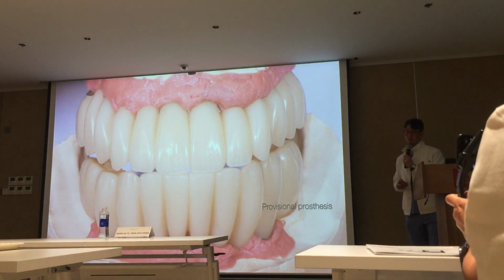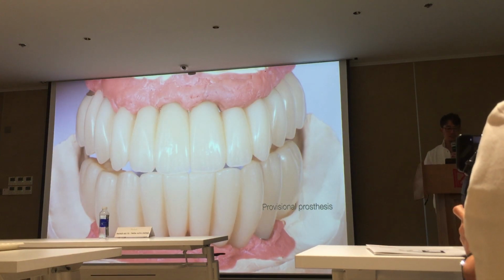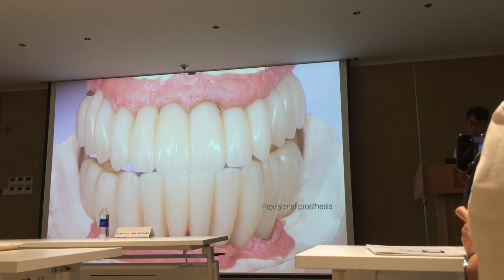And we do have this. We do have a beautiful result. And this is provisional prosthesis.